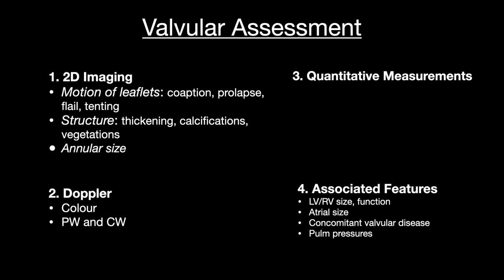I guess from an ICU perspective, we're mostly interested in severe hemodynamically significant valvular lesions. And to be honest, you may know that they're hemodynamically significant without having to quantify them in detail with echo. But this is an echo lecture, so here we go.